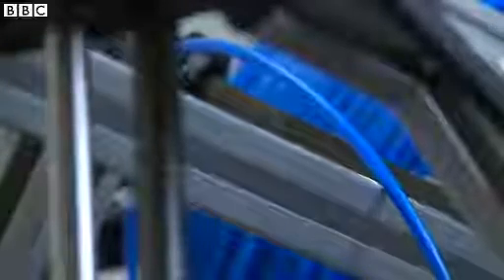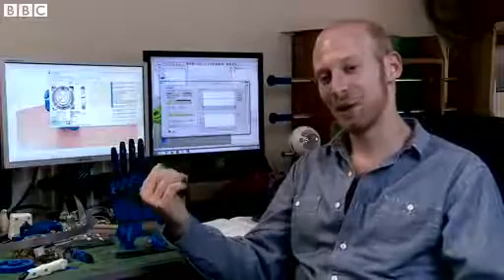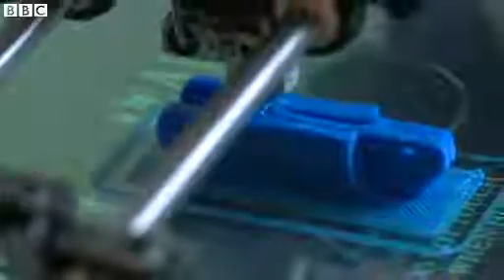None of this would be possible without 3D printing, because prototyping in plastic like this would cost a lot. Every single time that you want to get a new part made, you'd have to send off for it, you'd have to wait for it to be delivered, and you'd have to pay a premium for all of that service. With a 3D printer, I could, for instance, come up with an idea, model it on the computer, print it and test it, all within the space of around 2 hours.